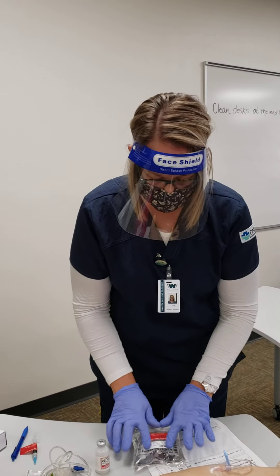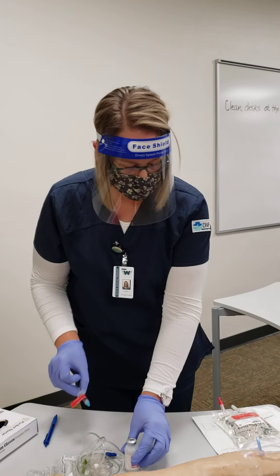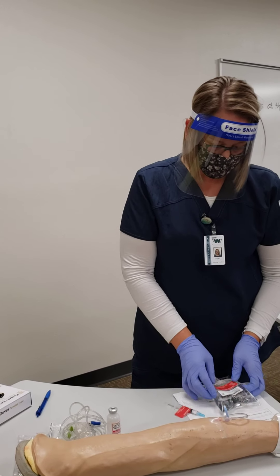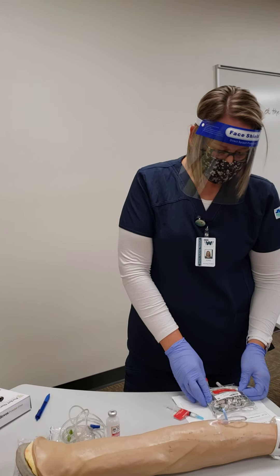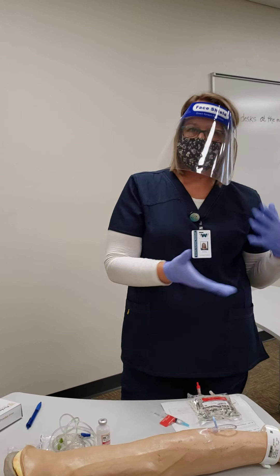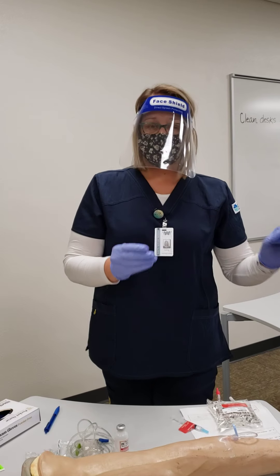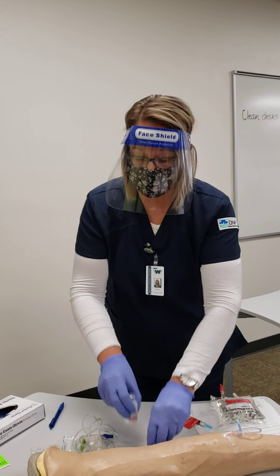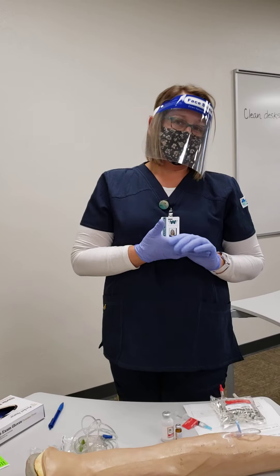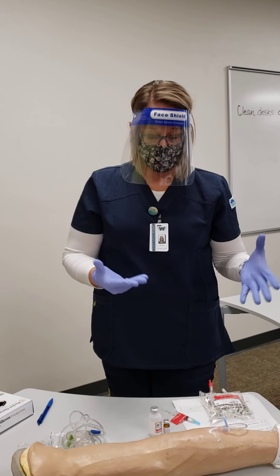I double check to make sure I have all the medications I need before going into my patient's room. I have my morphine sulfate, I have my potassium chloride mixed in my normal saline — that is what is on my medication administration record. I would take my gloves off, do my hand hygiene, and then head to my patient's room with my medications so I can scan them and make sure everything is correct.